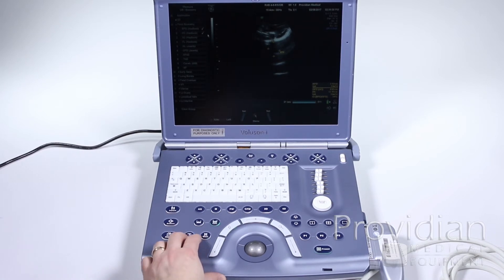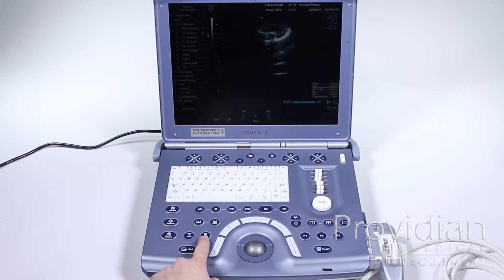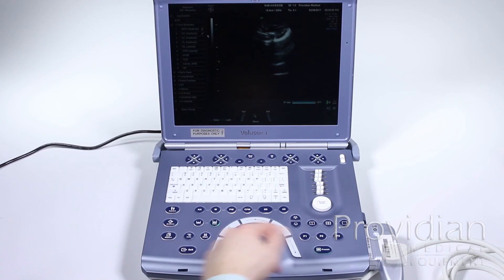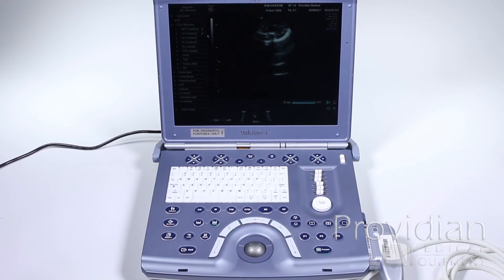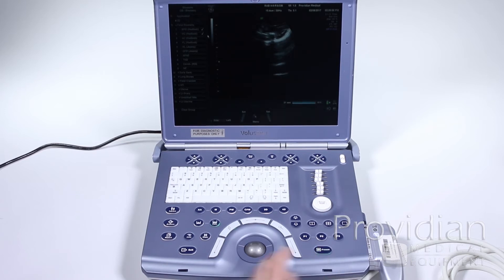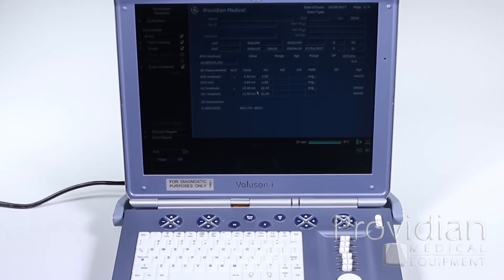If I want to clear or delete measurements, I have two keys: the clear key and the delete key. Clear is going to completely erase all those measurements. Now since I'm frozen I can also take a look at my reports — click the report button over here and it's going to show the measurements I've made. I can click on them and edit those measurements as well.